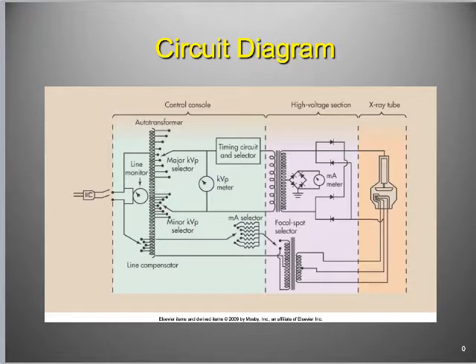Most X-ray tubes are going to be operating at 220 volts, right? You can find some like the portable we've got, the old Siemens. It plugs into the wall and literally operates off of 110 volts. So it's a battery falling load generator that operates off of just a standard outlet. But most of them operate off of 220 volts. So that's the power source.